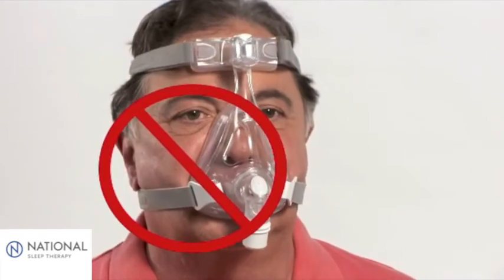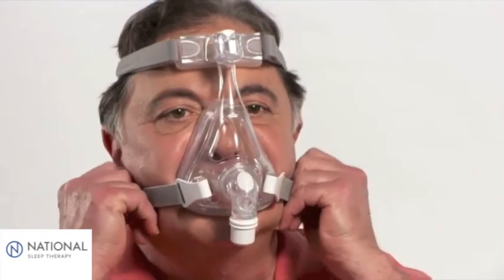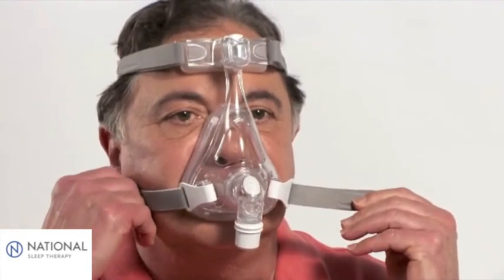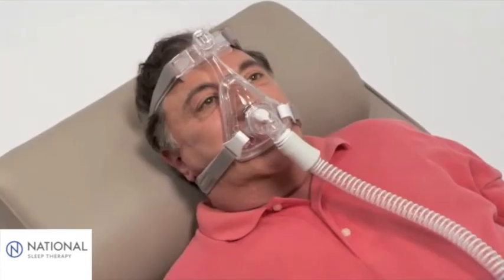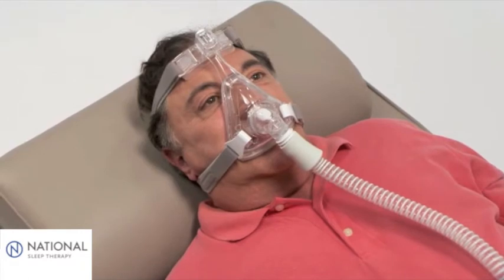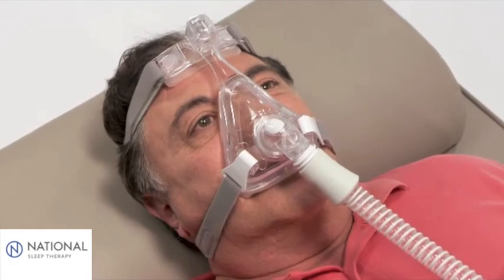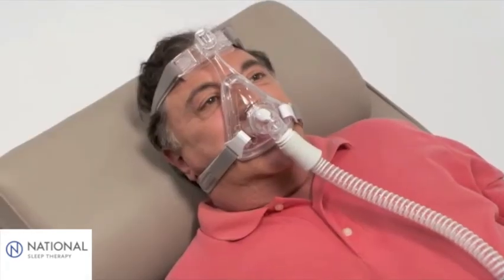If your skin bulges around the mask or you see red marks or impressions on your skin, loosen the headgear straps. The headgear tab should be closer to the front of your face and not over your ears. Excessive tightening of the headgear may cause unnecessary discomfort and leaks. Remember, not all leaks have to be corrected when using a Philips Respironics therapy device.